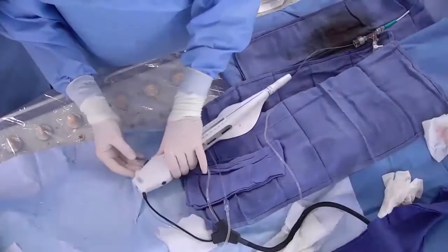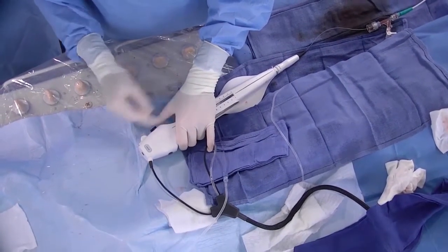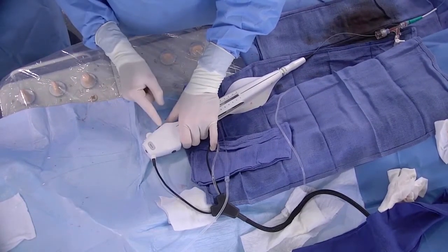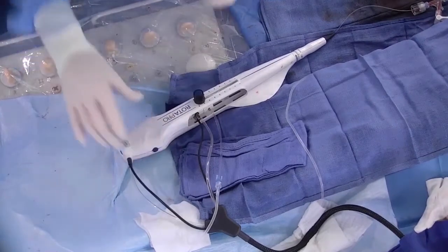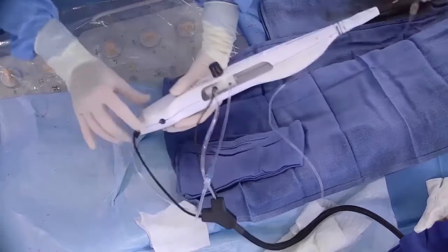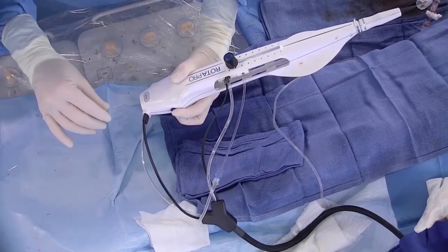So I will use the torque, as you can see, to release the brake of the wire. So I push this button, I push the torque, and you can see the button releases the grip on the wire, doesn't it? Yeah. And to start the Dynaglide, you have to push on this button on the other side. Do we need to switch from the Rotablator mode to Dynaglide mode first by pushing that one, perhaps? Yeah.